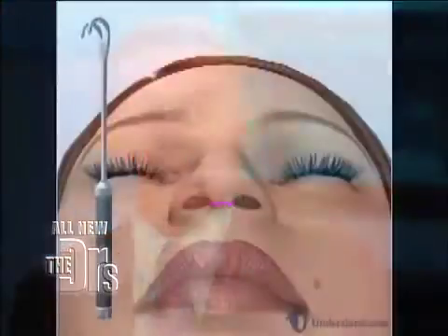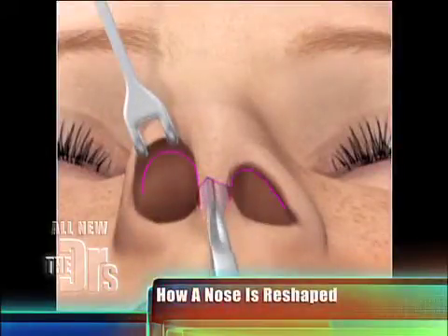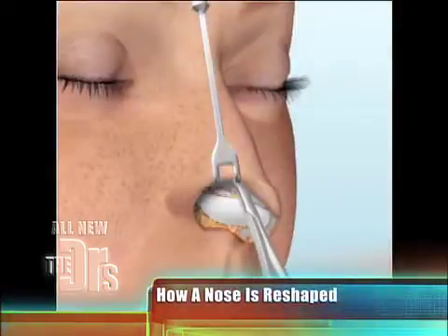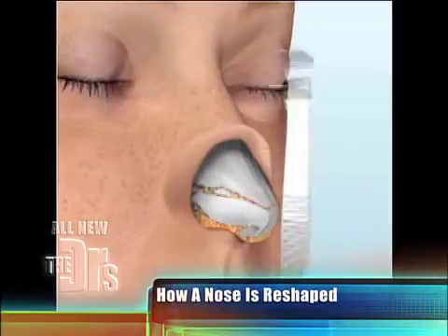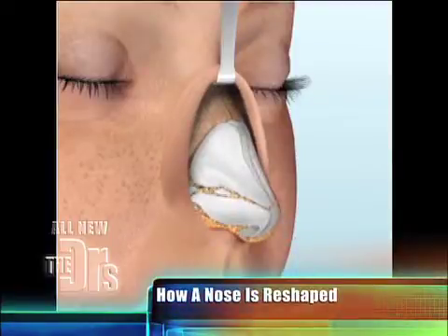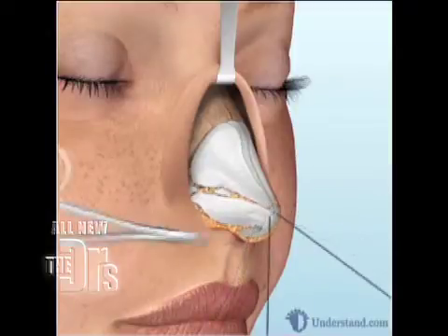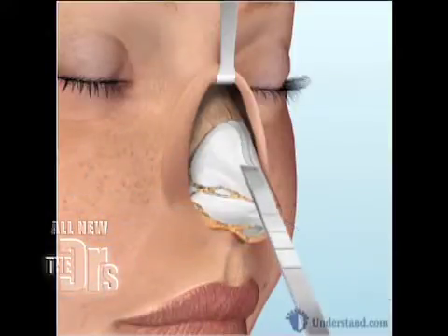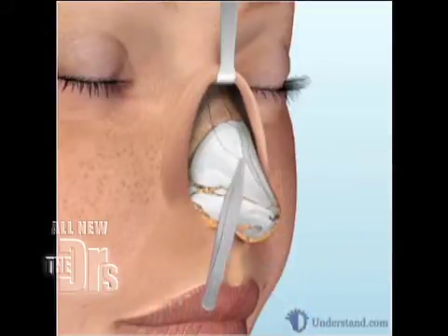Once we did that, we went into the cosmetic part of the nose — the so-called rhinoplasty — and we have another animation here. They made an external incision in that one, which is called open rhinoplasty. In this case, we did not make an external incision of any kind, so this is called closed rhinoplasty. First maneuver, you see us elevating the skin from the underlying bone and cartilage. To reduce the bump, we take down the cartilage — it sits in the middle third of the nose — and we rasp the bone. At that point the bridge is too wide, so we have to go in and realign the nasal bones, perform osteotomies to narrow the nasal bones.